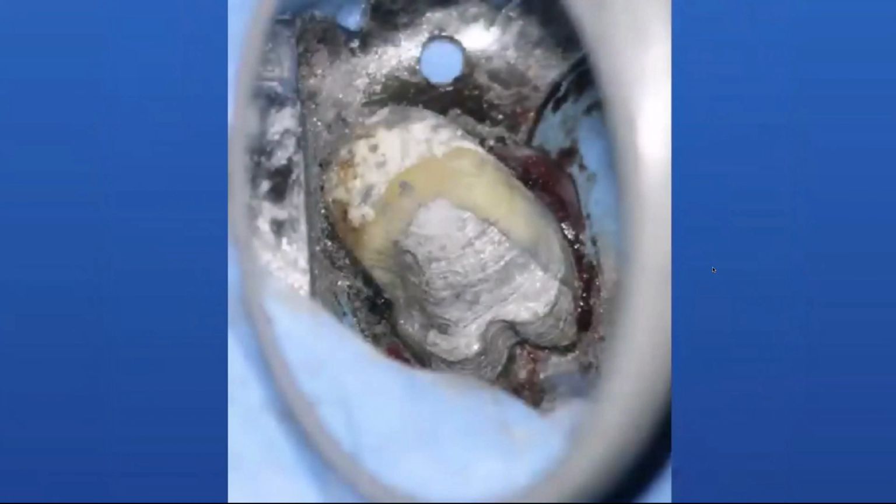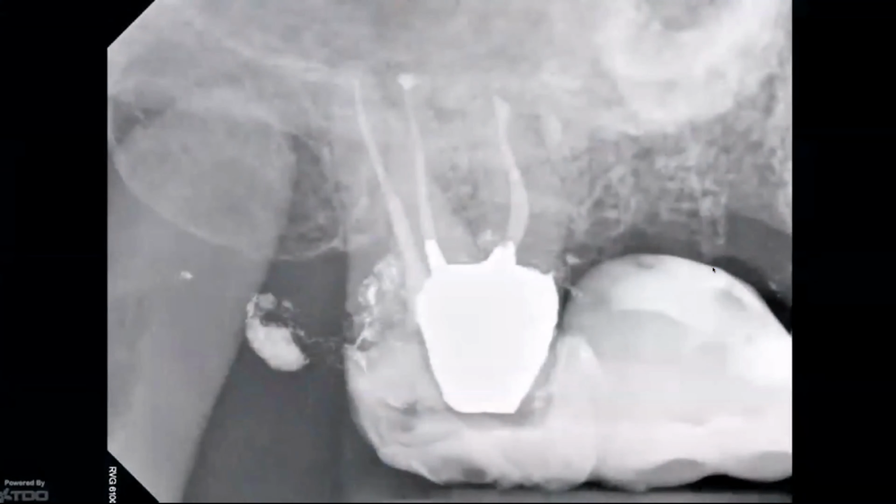So this is the view looking inside the platform after having completed root canal therapy, completed the obturation, and hollowed out the matrix in order to accommodate the restorative materials. So this is what it looked like. I basically fluted, festooned the furcation to follow the root of the tooth and ensure that there wasn't going to be an overhang. And as you can see, most of the carious lesion was all on the buccal, and the palatal aspect of the tooth was left untouched. I mean, in these cases, the endo is kind of the easy part. The restorative is by far much more complicated.